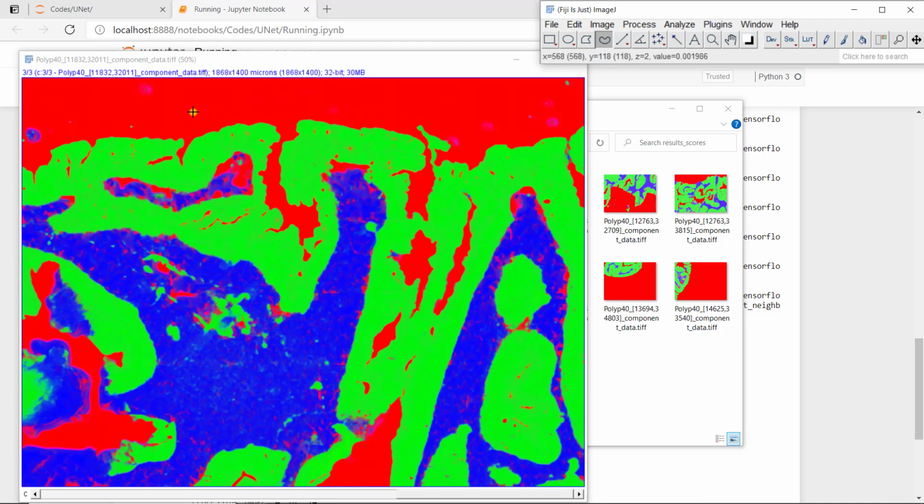Clearly it pretty well converged to something that looks like background. If I go in this, which probably corresponds to epithelium, I have a low value for stroma, 0.08, 0.92 for the second class, and 0.07 for background. So here we have the scores for each class.